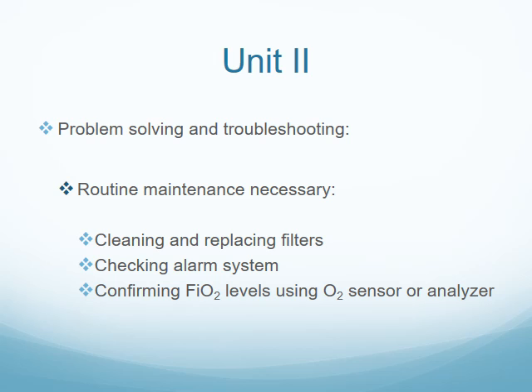We have to make sure that the equipment is properly cleaned. There's replacement of filters, checking the alarm system on the device if it requires that, and confirming FiO2 levels by using the O2 sensor or analyzer as stated previously.